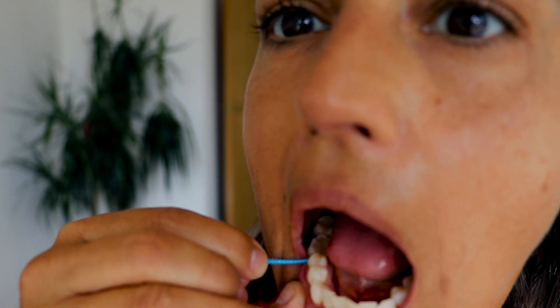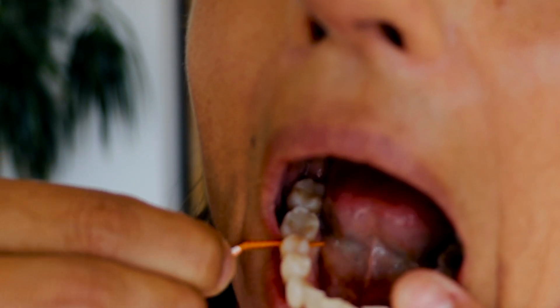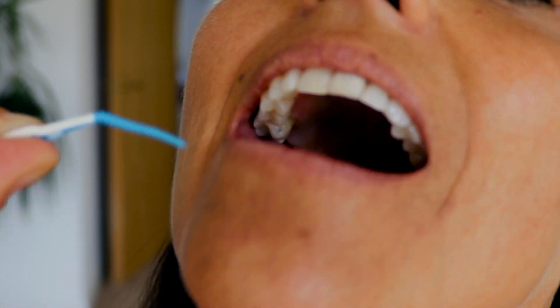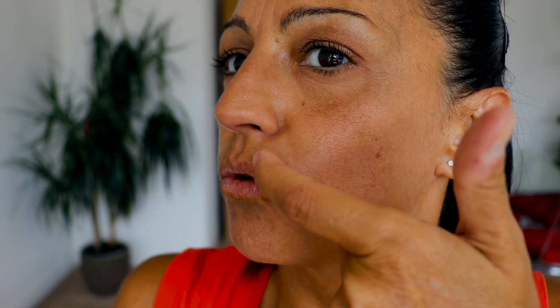If you don't clean the brush under tap water between every single space, you will spread plaque from tooth to tooth — and we don't want that. If the next space doesn't go through with the current size, use the smaller one. For the top teeth it's the same technique but just more difficult to see. Clean under the tap water after each space, and if the space is too tight, use the small one.